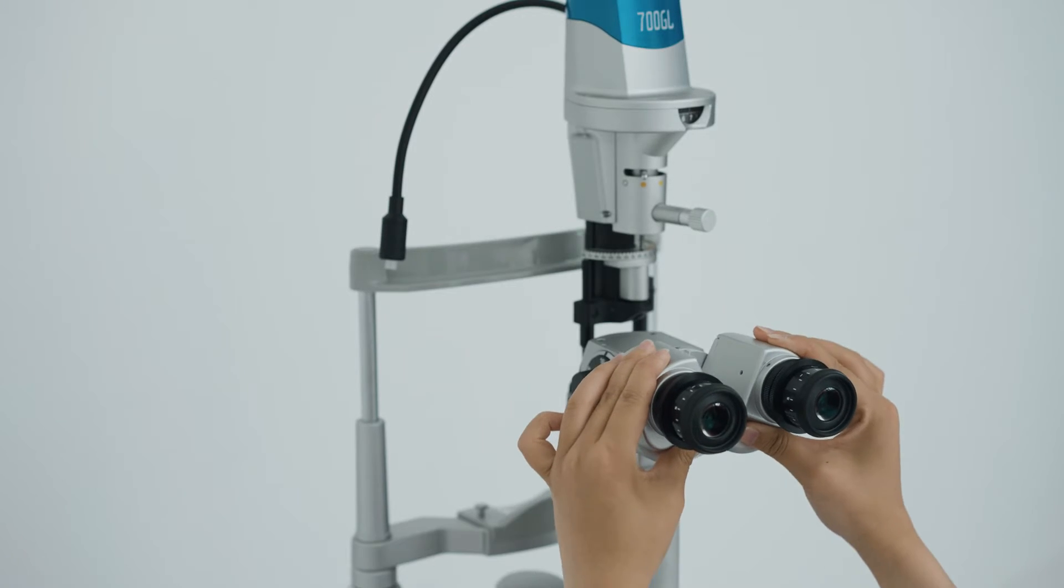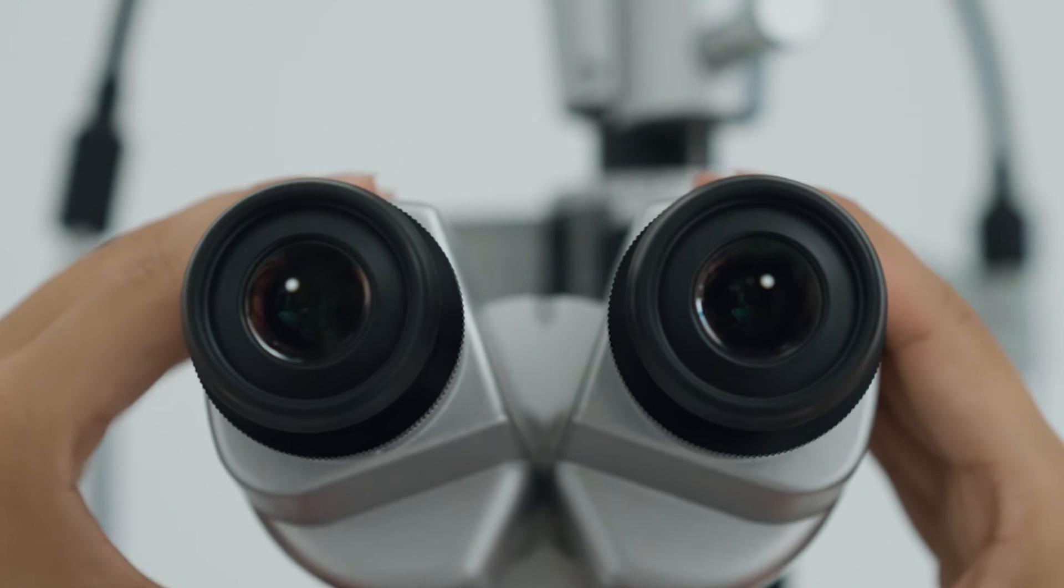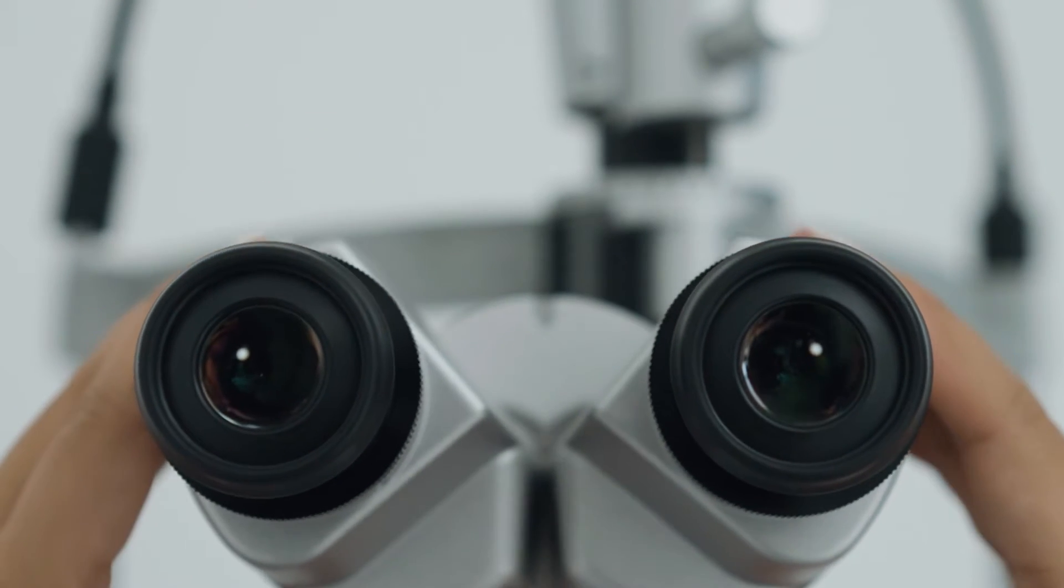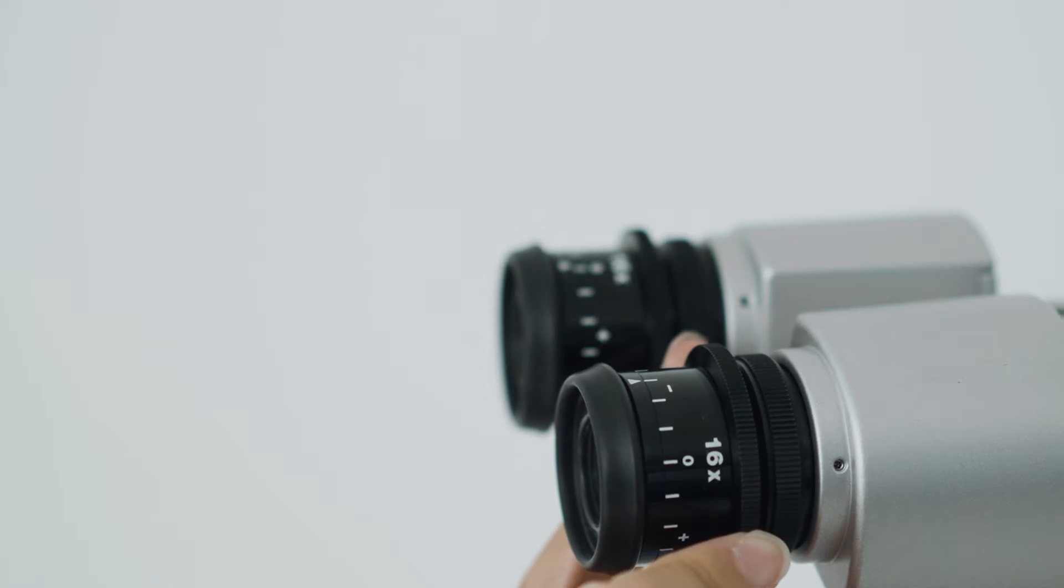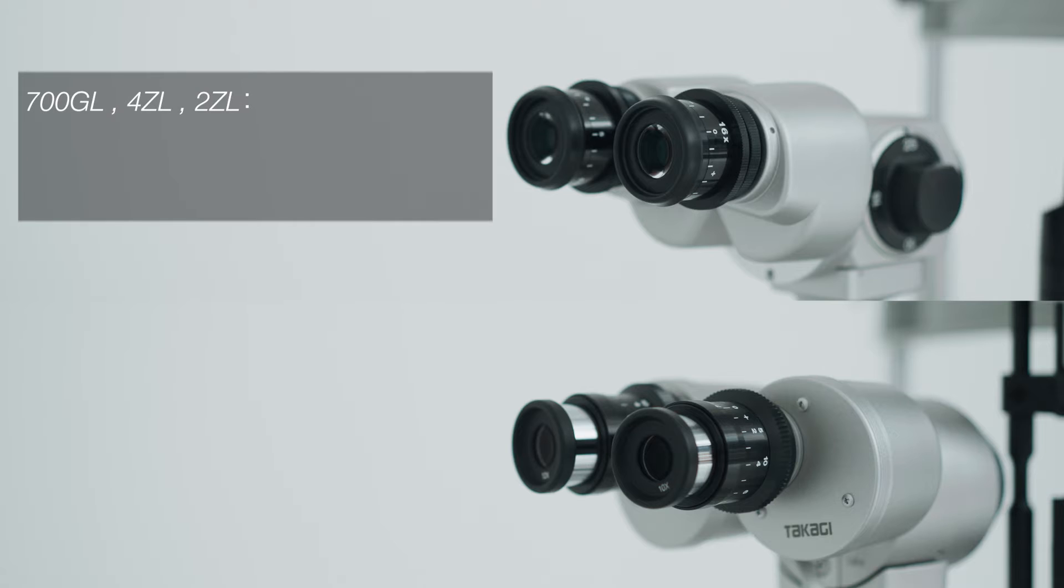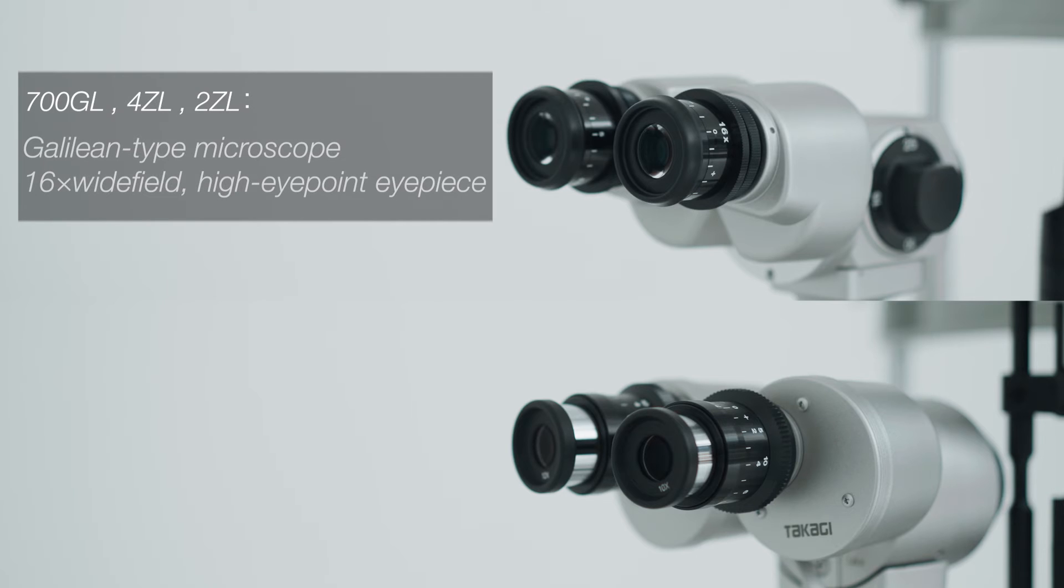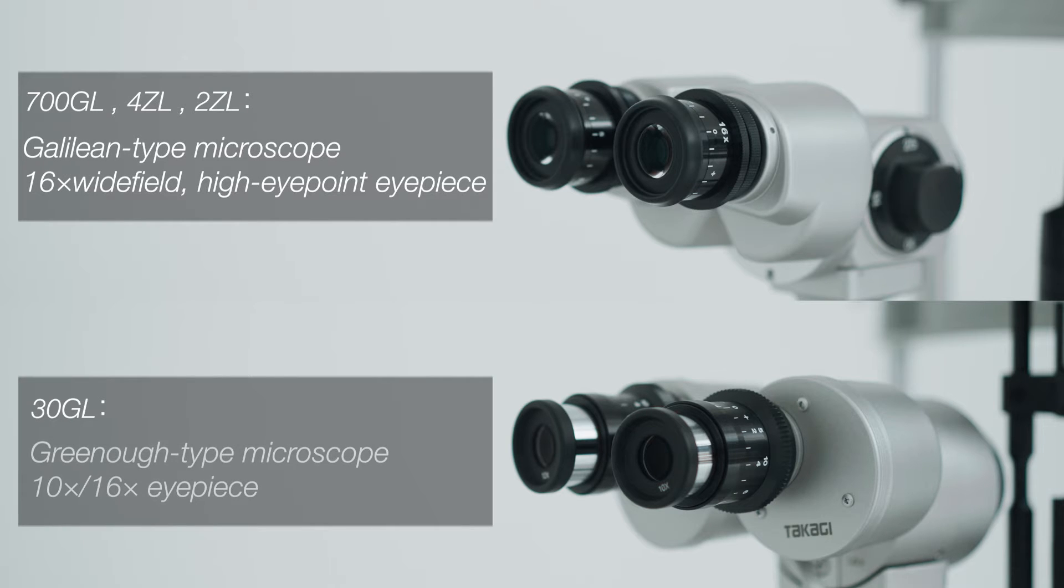700GL, 4ZL and 2ZL are equipped with high-eye point eyepieces. The distance from the observer's eye to the eyepiece is sufficient to allow comfortable observation even when wearing spectacles.